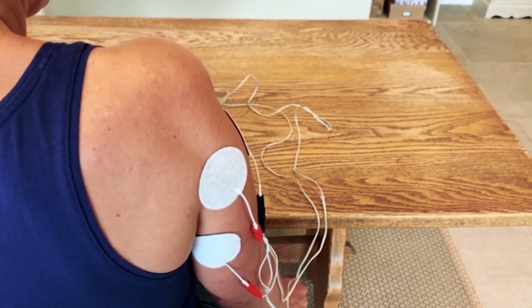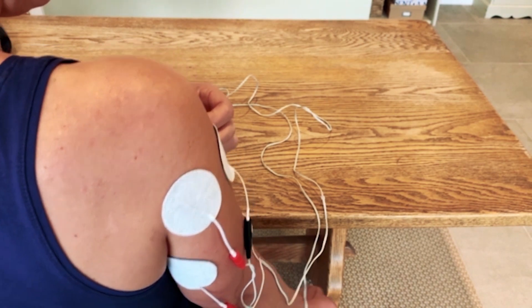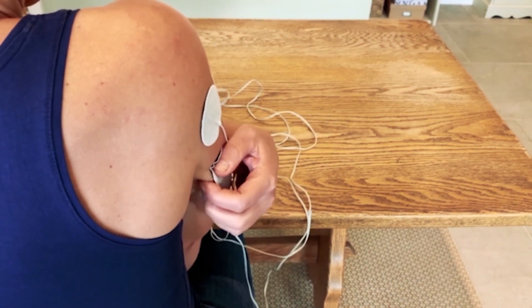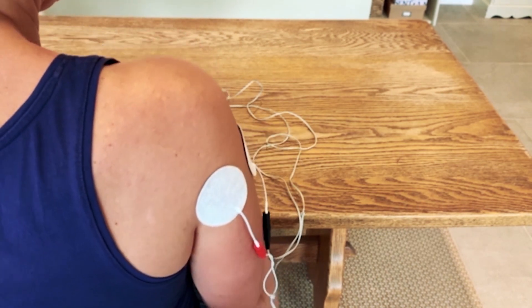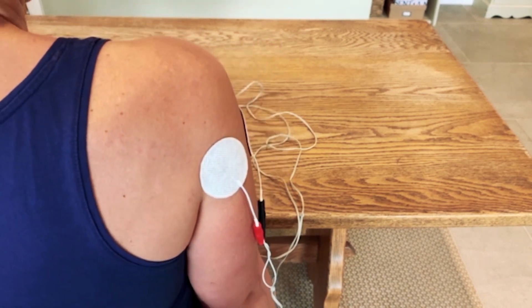Setup number two with one lead: take away the electrode right at the front and take away the triceps electrode. So you're just left with the mid and posterior deltoid.